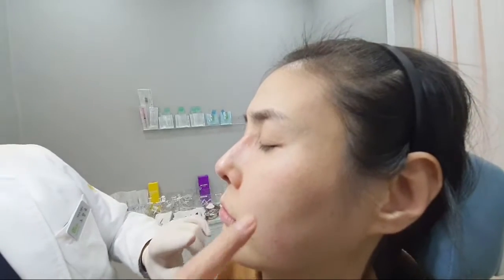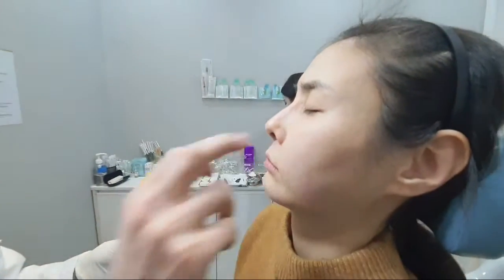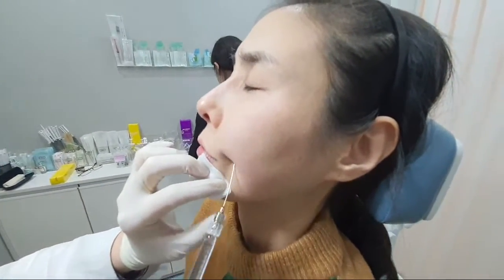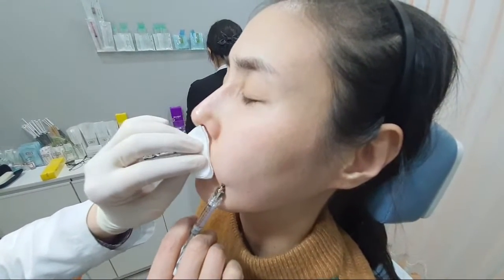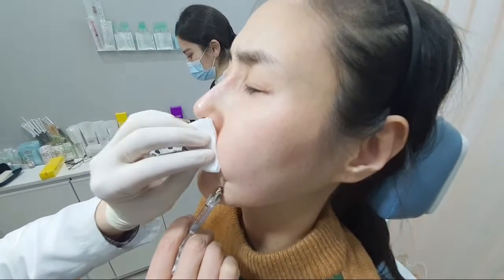지금 볼을 보니까 여기가 조금 적어서 여기 조금 넣을게요. So if you look at the face, the left cheek feels a little more voluminous. The right feels a little sunken, so add a little more volume to the right side. 목볼이 조금 더 살짝 들어갔어요. 지금 아팠나요?